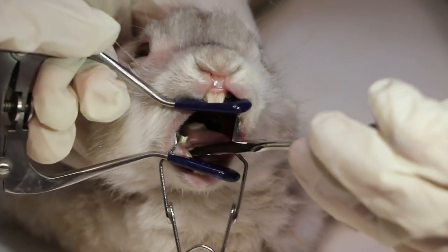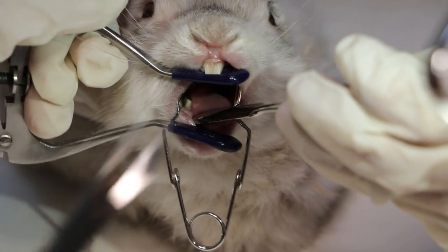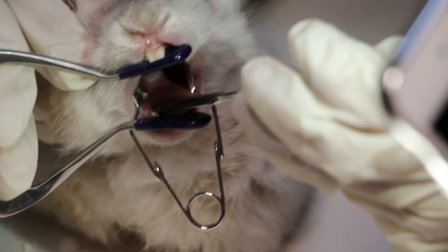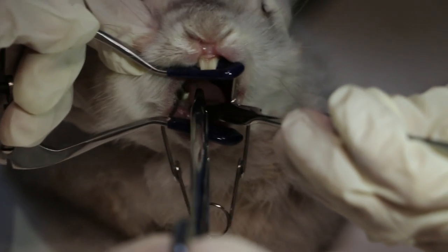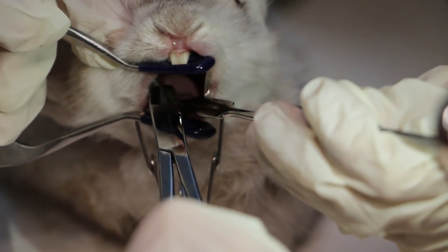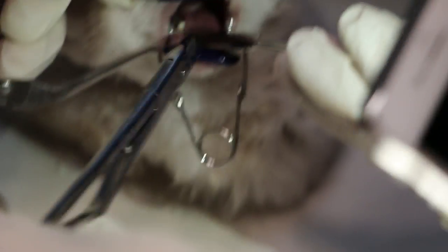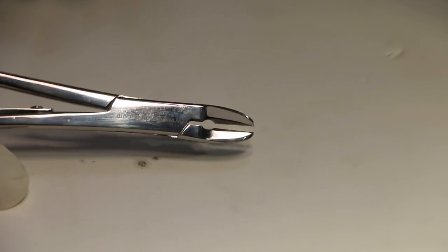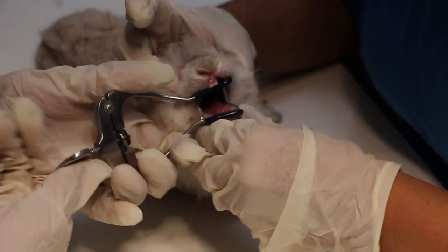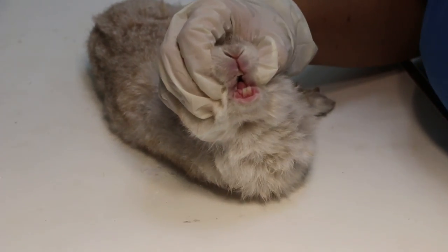The last instrument is the molar cutters. Some molars have sharp spurs — this one doesn't. The molar cutter is used to cut the tips of the spurs so they're not so sharp. Sharp molar spurs can cut the tongue or the cheek, making it very painful for the rabbit. It looks more like a wire cutter.